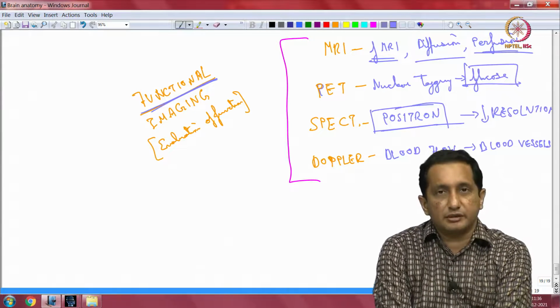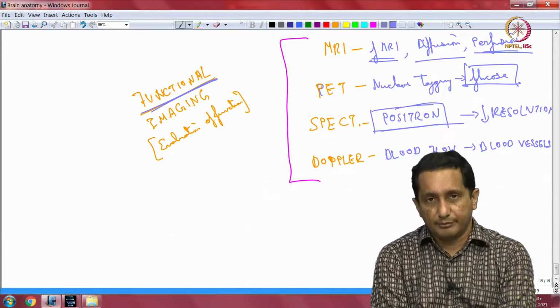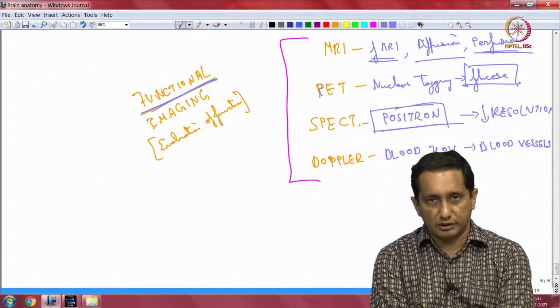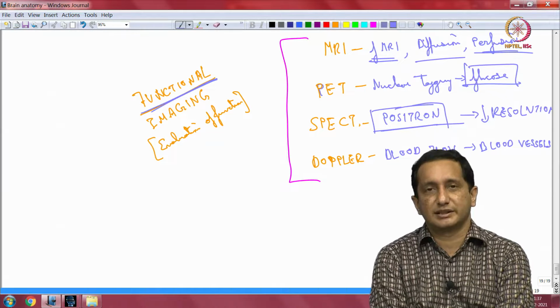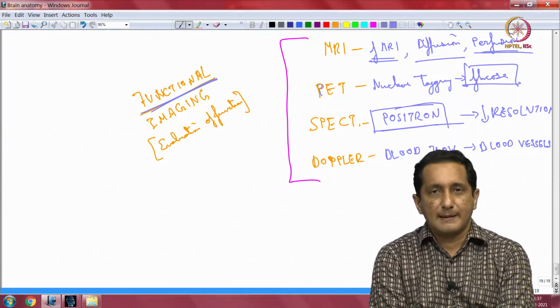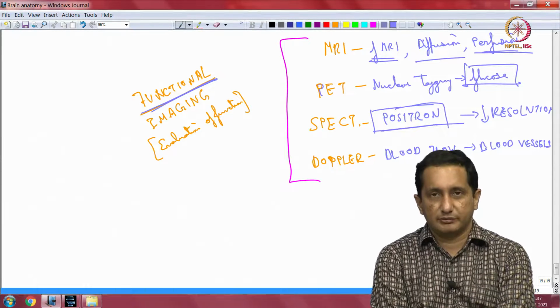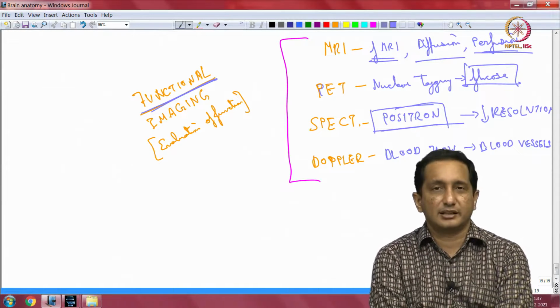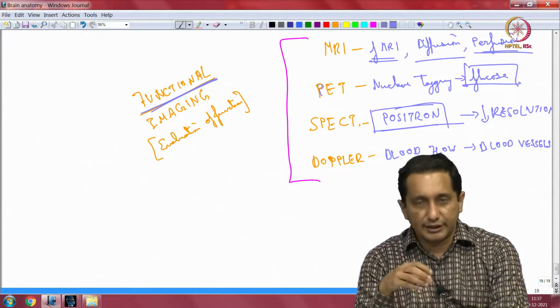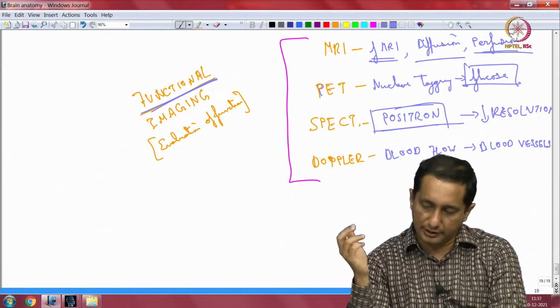It is also necessary for me to explain the next part of the story, which is the anatomy of the brain in imaging. Most of you would not, in any part of your career, both academic and in your work, have the necessity of seeing the brain either live or as a cadaver brain. So work would be dependent on images which you get, and images from live people are basically MR, CT, rarely ultrasound, and PET and SPECT of course. So it is necessary that you understand how these images are generated before actually seeing the images, and I need to put the context proper before I go into the imaging part of the story.